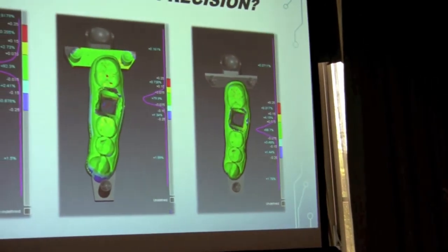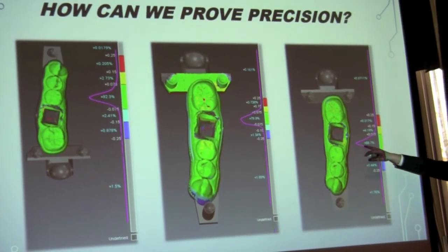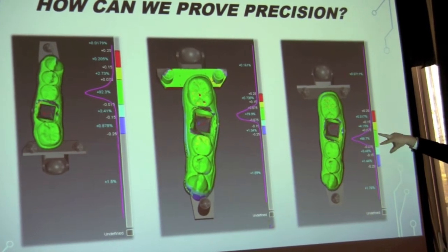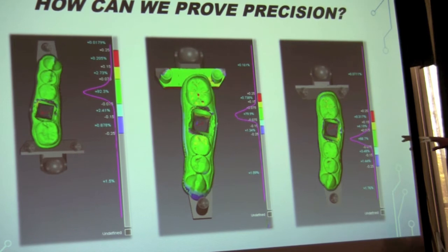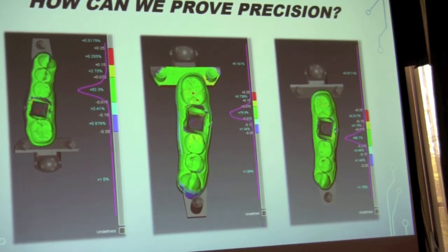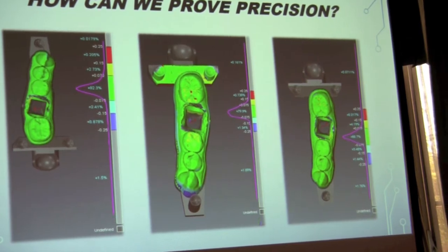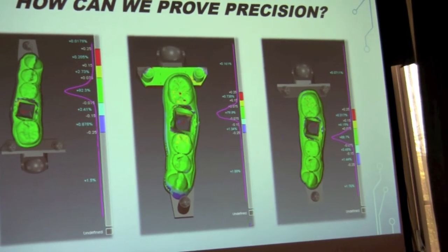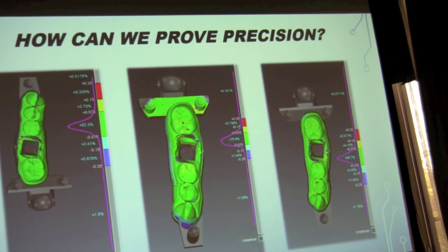So what we're looking for when you read this heat map, and you have this gauge, is we want it to plateau almost right at 0. So between these two dots, we have a 0 point, and the highest precision is almost at 0 with this 3D printer. That one is a little bit off, and on the Asiga it is just about spot on. Also, I can see within the precision of the printer, 92.3% of it matched up to the actual printed model, to the actual STL, which is what we're looking for. We want that type of perfection. The other printers, they both did really well, it's just you pay a lot more for it.